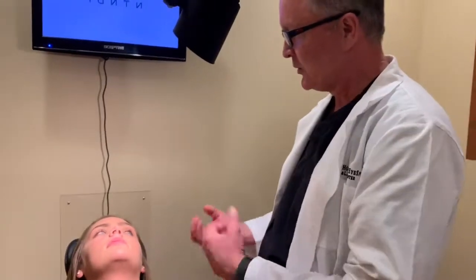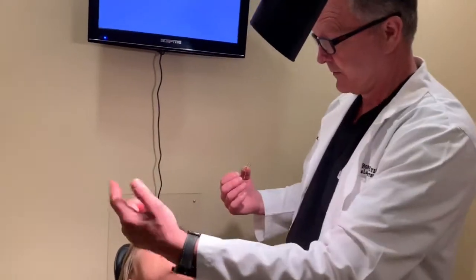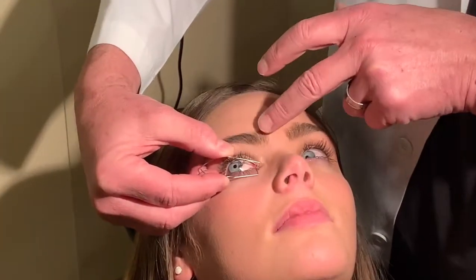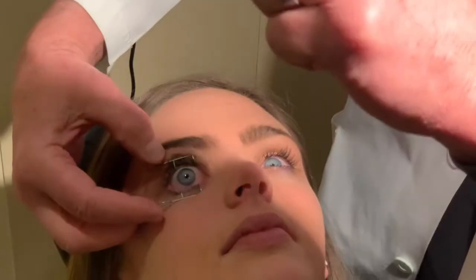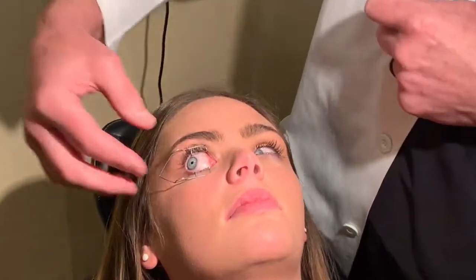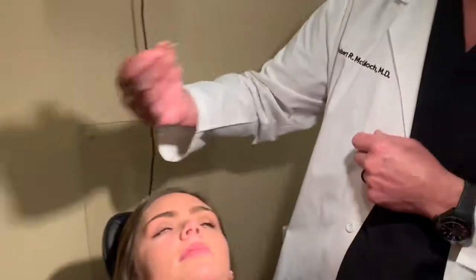Now we're going to do the other side. You can use your right or left hand, but I'm going to do it the same way. This time, you're going to look away from me — so I want you to look away from me, and I'm crossing over. Again, I'm putting it on the nasal sclera, and now centering. Look right towards my finger. To take it out, I want you to look over to your right, and I'm going to cross them and bring them out nasally.